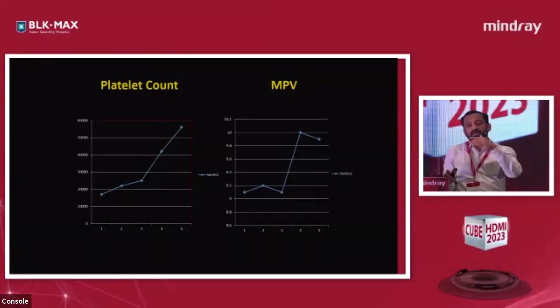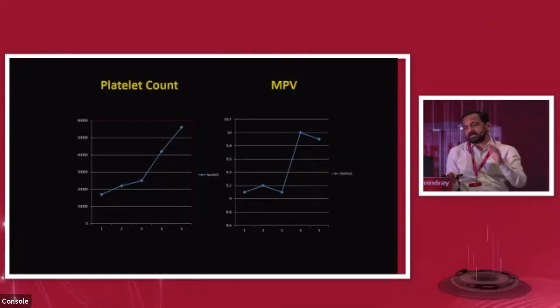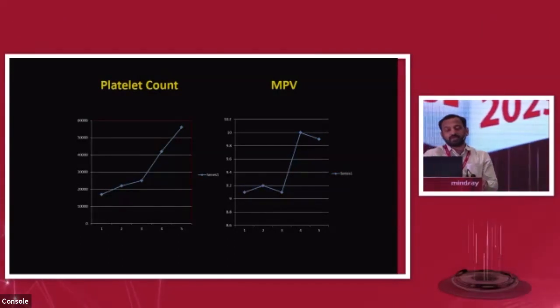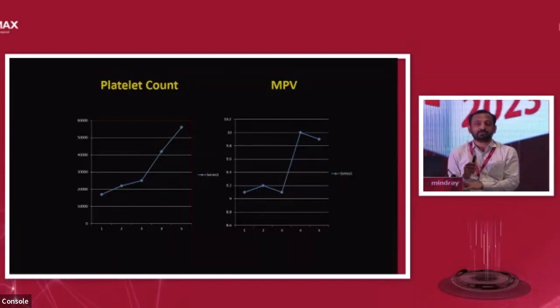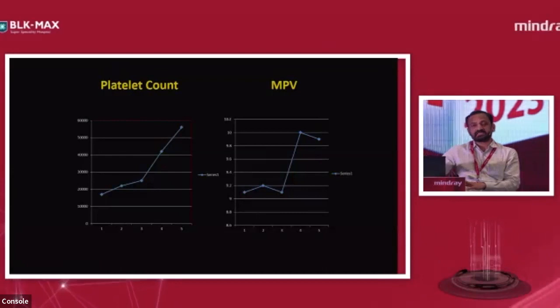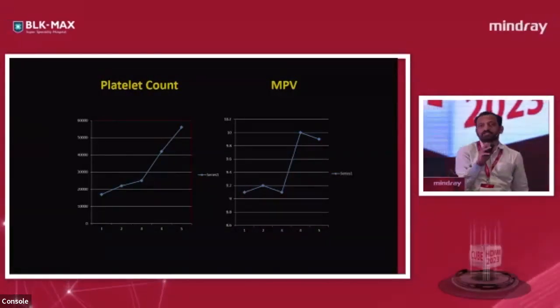So that may be an area wherein the IPF goes down once the platelet recovery starts. Even in this recovering phase, the count recovery was not significantly high. From 30,000, it has gone to 50,000 only. But the MPV was significantly high, and the last count showed a slight drop or maintenance of the mean platelet volume.